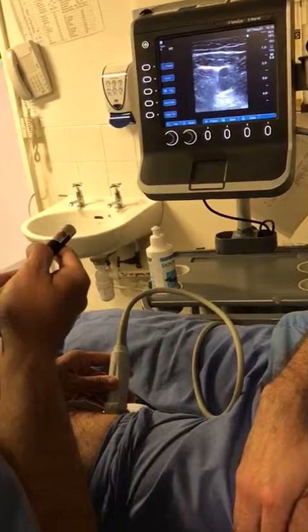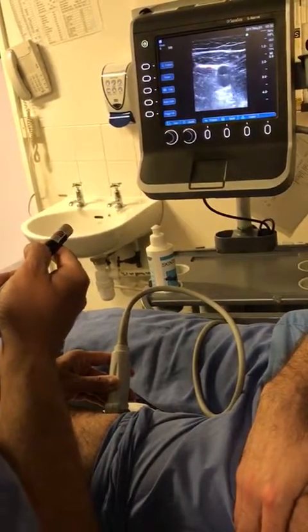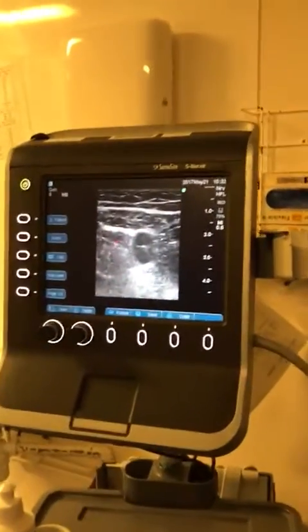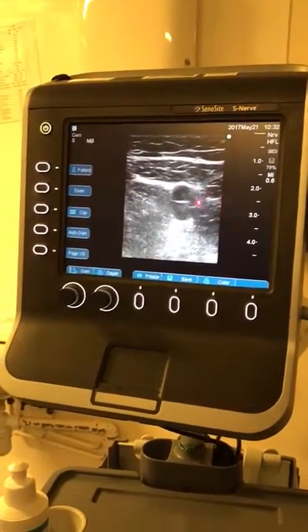And you now see a membrane, which is much more clear in this image. White, black, white — that's your adductor magnus muscle, and that's your vastus medialis muscle.